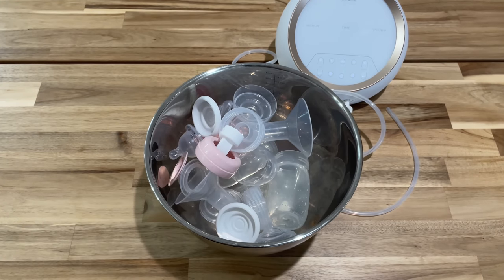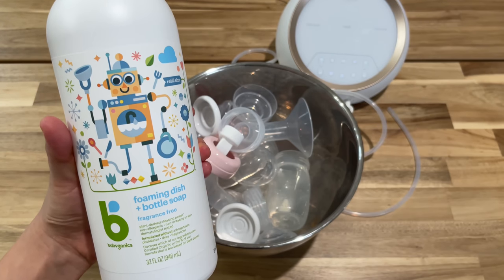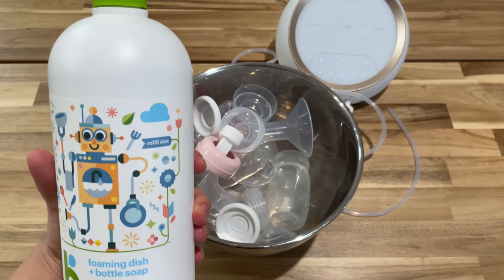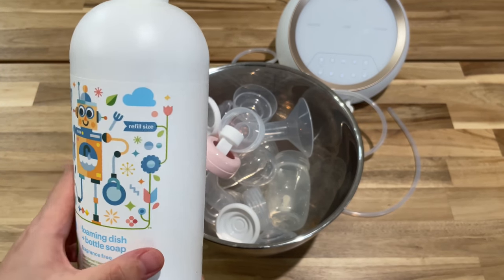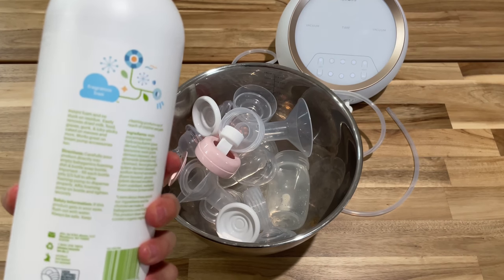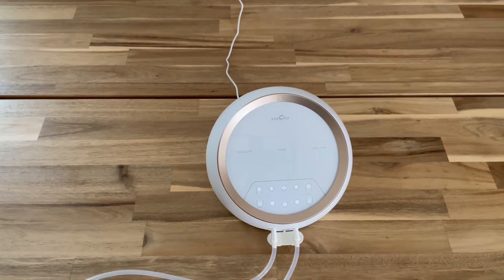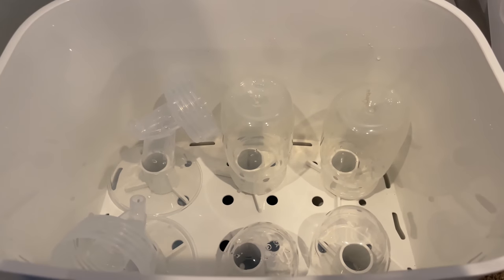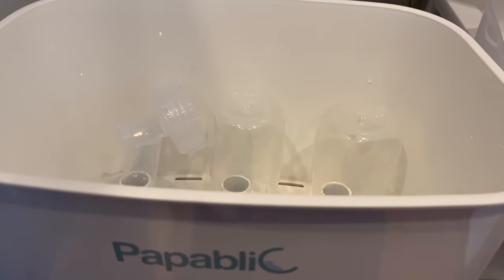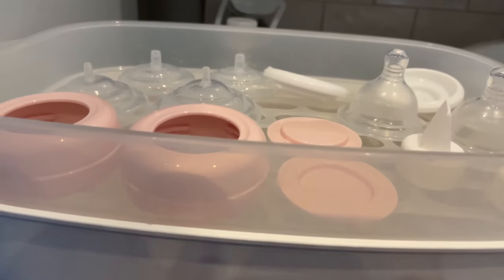Put all washable parts into a designated basin and wash each piece in warm soapy water, then rinse with hot water. My favorite soap to wash pump parts and bottles is the Babyganics — I highly recommend it. It washes really well and takes away all those milk residues. It's also plant-based and fragrance-free. After the parts are washed, you can sanitize them. I like to sanitize them in a sanitizer machine like the Papablic, which allows you to sanitize and also dry them. After drying, they can be assembled before the next use.